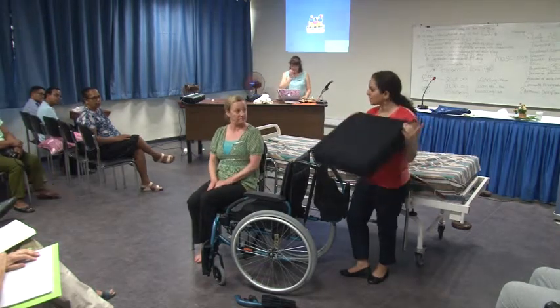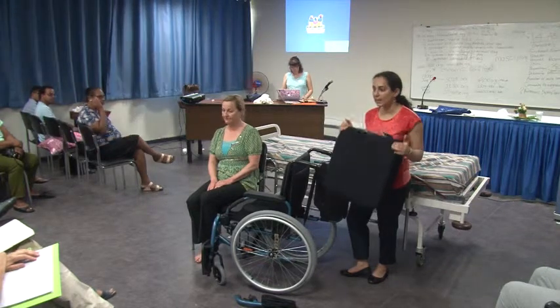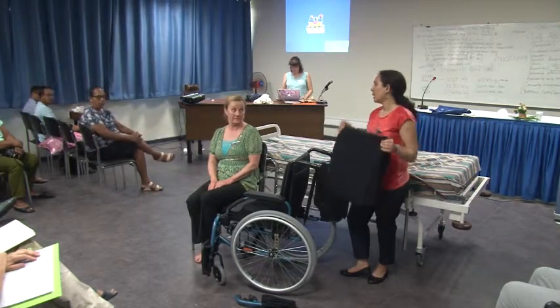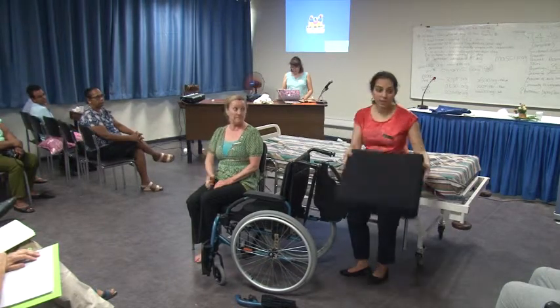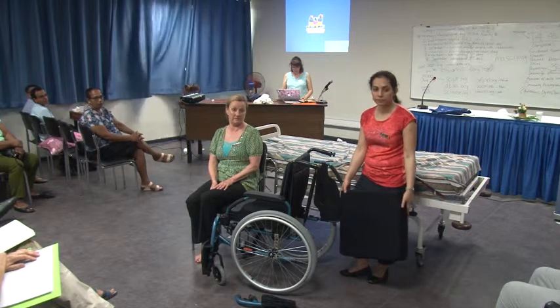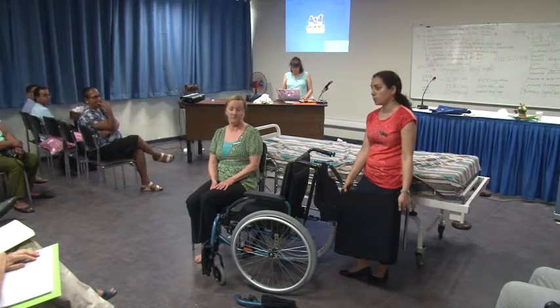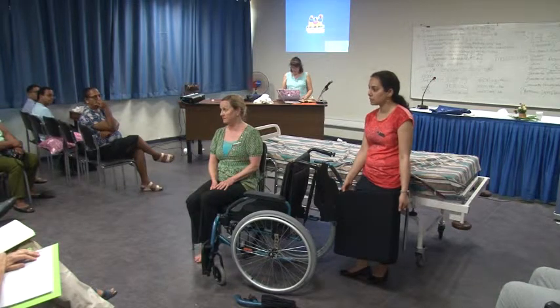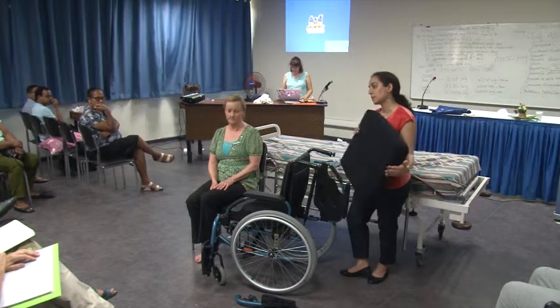So please ask us if you need more information about these cushions. And if you see anyone without a pressure cushion, please get in touch and give them pressure cushions. You can contact our hotline. Remember the hotline. There are different types of foams. It's not just one. There are different types of foams which have to be put together to give this effect.